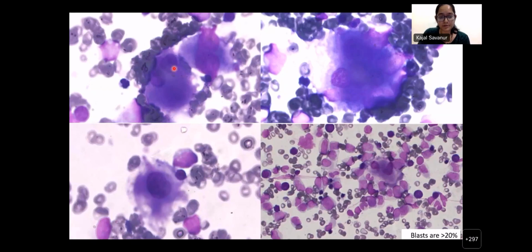Let's go over megakaryocyte morphology. Megakaryocytes divide by a process known as endoreduplication. As a result, their nuclei are knobbly and brain-like and have multiple lobes. As compared to that, this nucleus is abnormal because it is small and single-lobed, and the megakaryocyte itself is very small. This is a micromegakaryocyte. Now, in this megakaryocyte and this one, the nuclei are broken apart and connected by a thin strand. These are dysplastic megakaryocytes, and this, as you said, is a hyperlobated, dysplastic megakaryocyte.